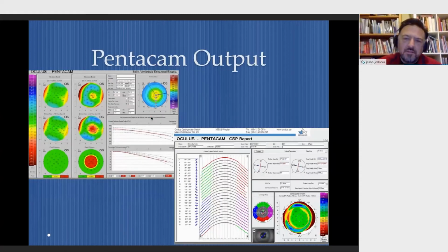And again, the other Pentacam outputs that are wonderful for screening for ectasias, the map on the left that you can see is the Belin-Ambrosio ectasia map. In the upper left we have 6 images, as you can see. The upper left picture shows what looks like a fairly regular corneal shape, but the posterior surface shows that hot spot, which you can see right there.